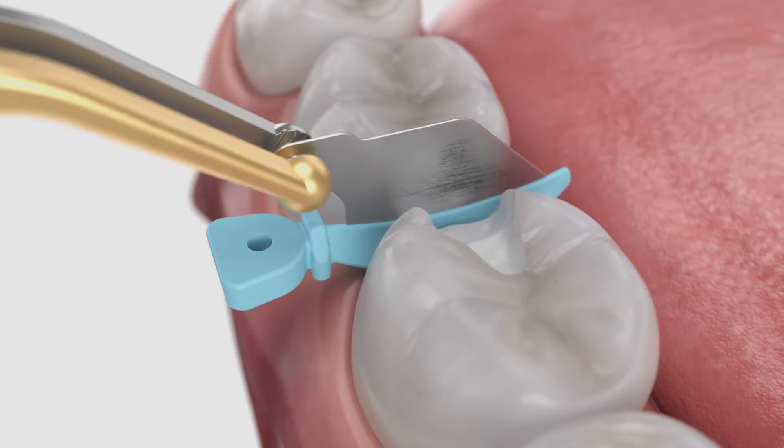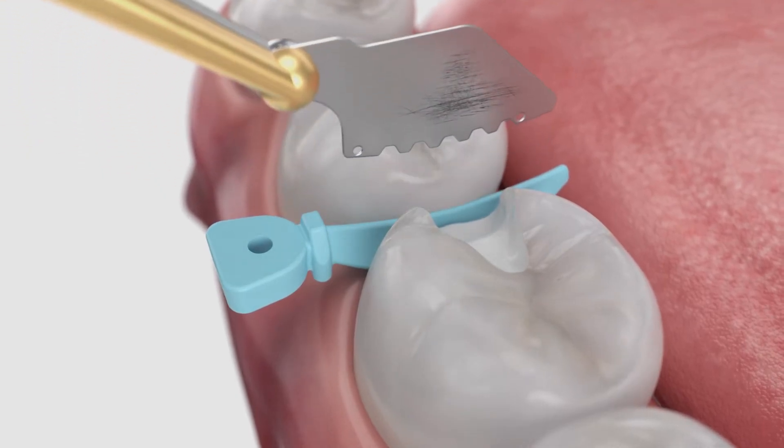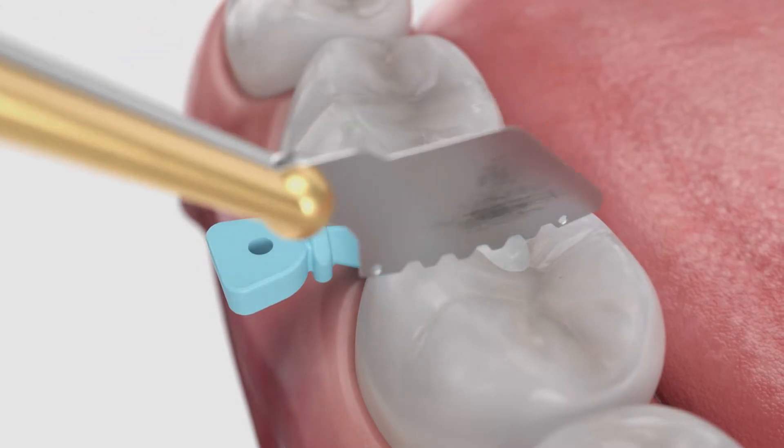Once the preparation is complete, remove the metal shield of the Wedge Guard. Use the pin tweezers to grasp the hole on the shield and slide laterally to remove.